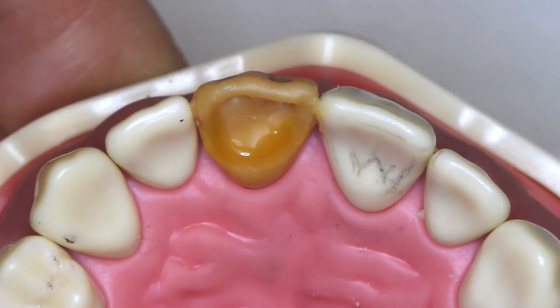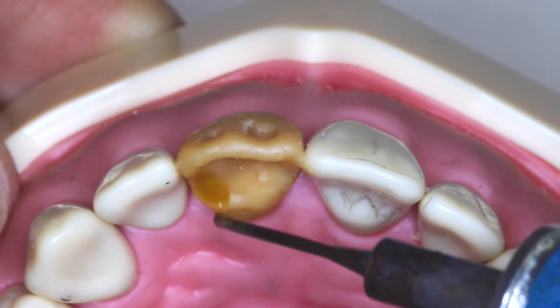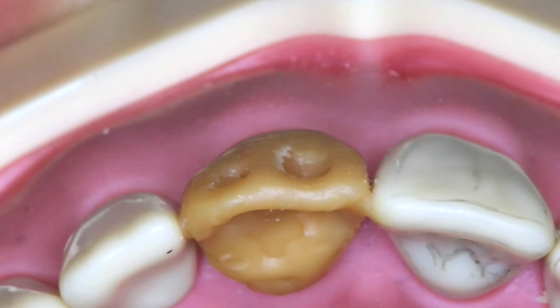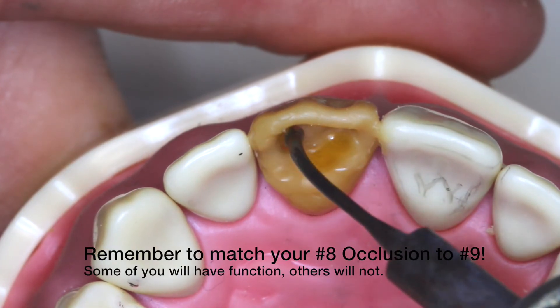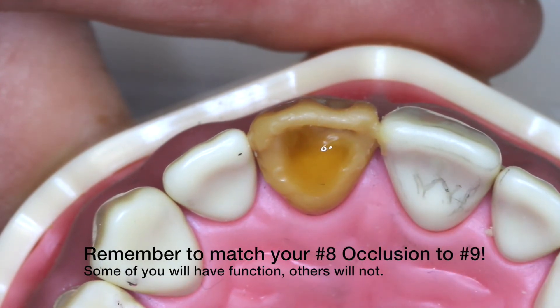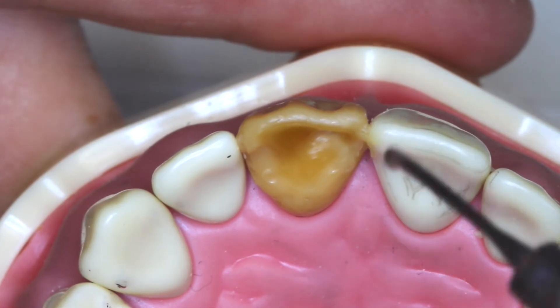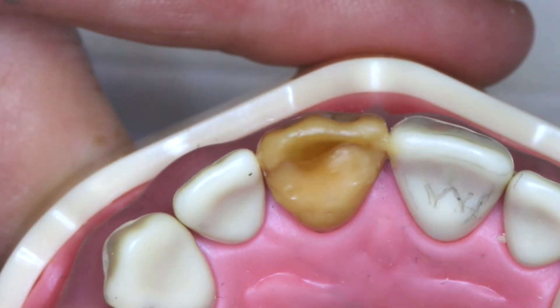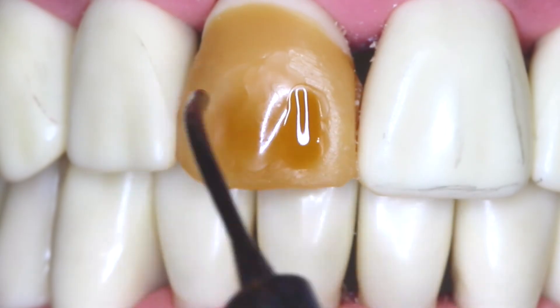Closing the typodont, we will look for occlusion. If you have occlusion on number 9 you would want it on number 8; if you do not have occlusion on number 9, you want to mirror number 8 to reflect that. Noticing that we have contact on the lingual of number 8 but not on the lingual of number 9 suggests too much pressure on number 8. We will shape the lingual of number 8 slightly out of occlusion to reflect number 9. As we start moving in protrusive movement, we will connect at the incisal edge of numbers 8 and 9 simultaneously. Letting the lingual chill, we will move back to the facial aspect and start our fill-in.